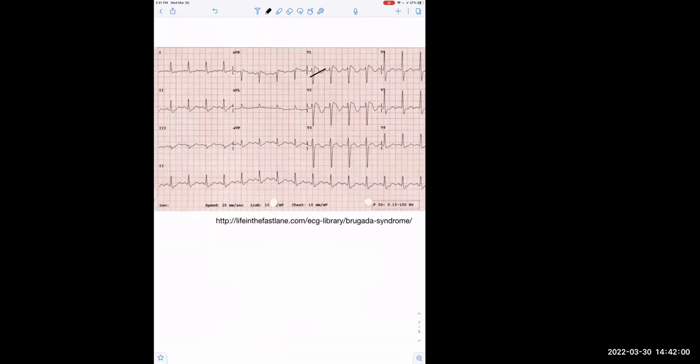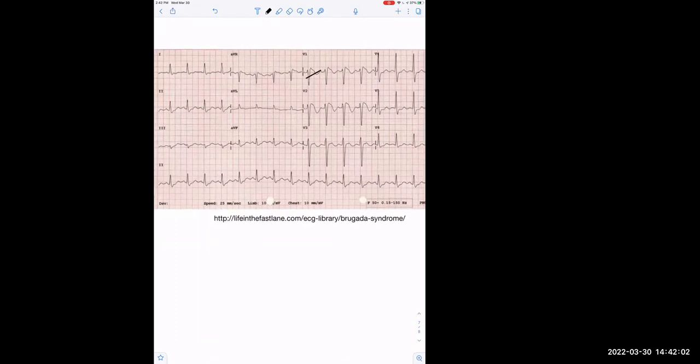Type 2 Brugada syndrome has its own characteristics. Again, we start off with characteristic number one, which is an ST segment elevation of greater than or equal to 2 millimeters. And then you have this thing called a saddleback. If we look right here, like in V1, it's very obvious. You're going to have to zoom in again, Ronel. Sorry about that, folks. No, thank you.